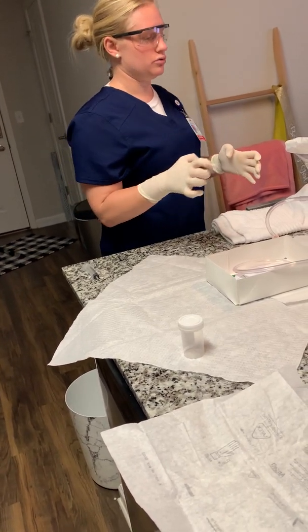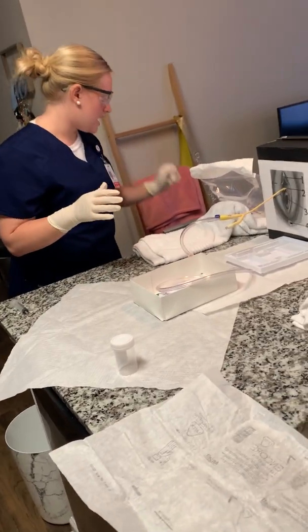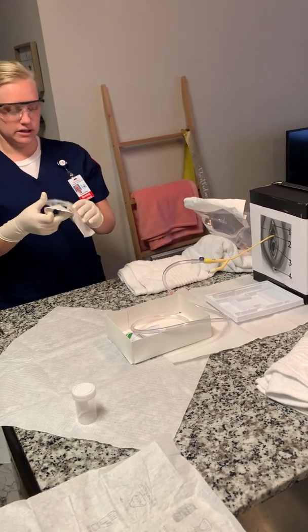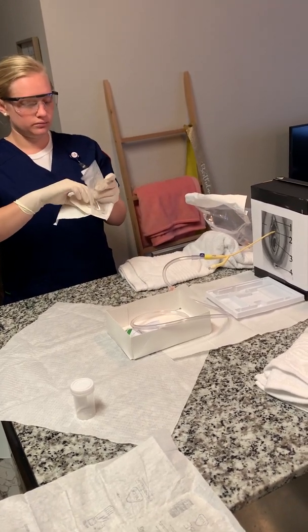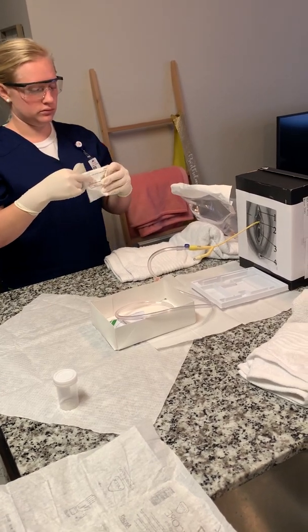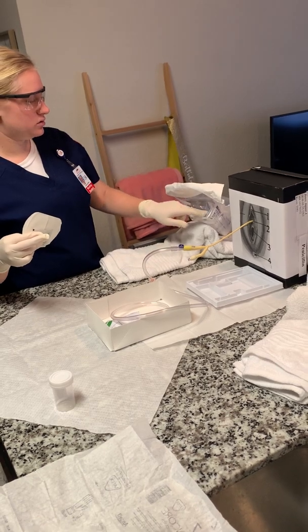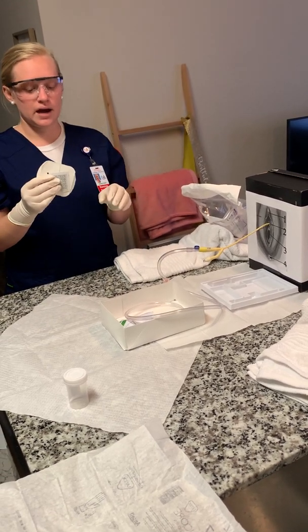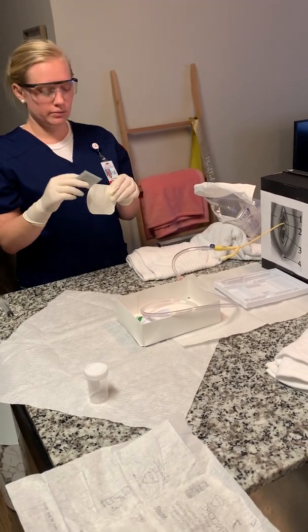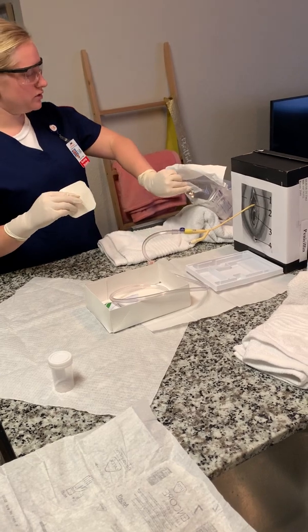Okay, so now I need to insert a stat lock. So I have my stat lock here, and I'm going to take it out of the packaging, and then put the packaging in the trash. And then I'm going to clean the upper thigh with the alcohol pad, like this, and then I'll disregard that.